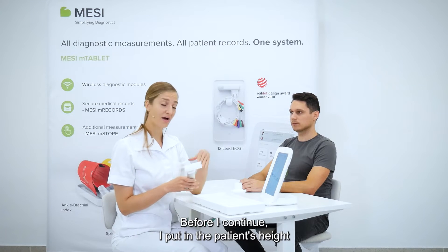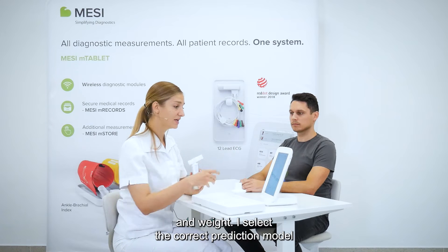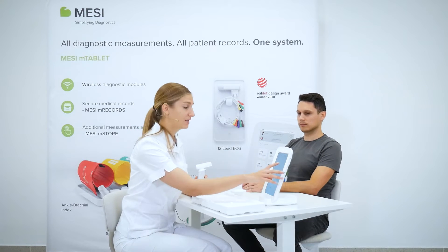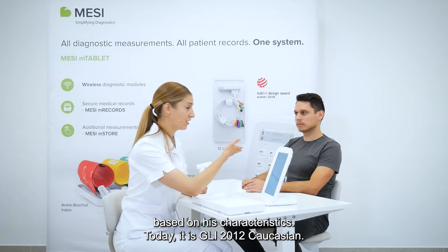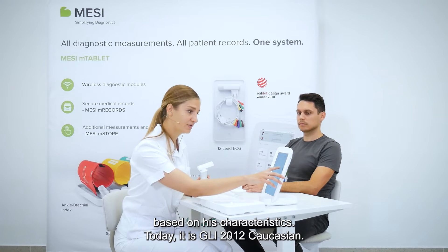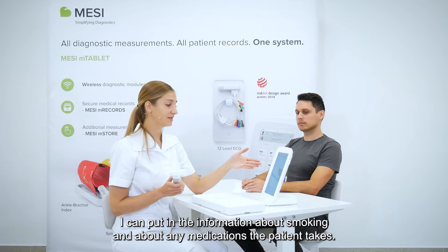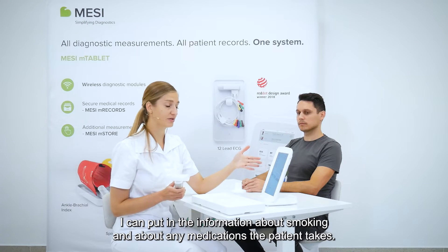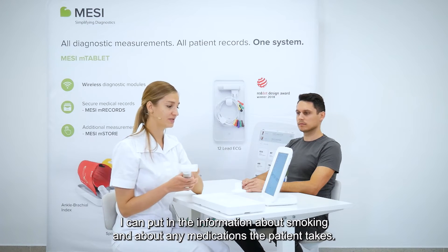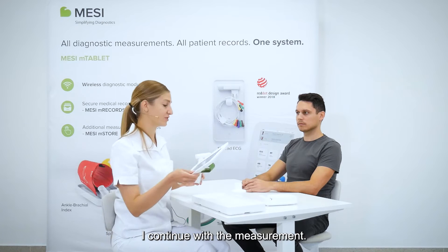Before I continue, I have to put in the patient's height and weight, and I have to select the correct prediction model based on his characteristics, which today is GLI 2012 Caucasian. I can put in information about smoking status and any medications this patient is taking, and then I will be able to continue with the measurement.